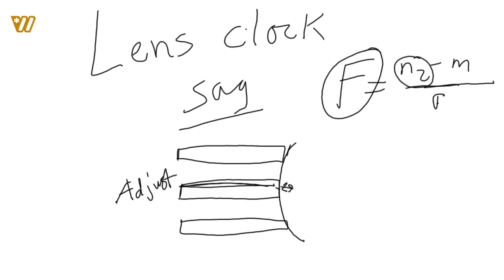So whenever you do lens clock, you get a sag value, but it doesn't actually give you a distance, it gives you a dioptric value, okay? And if you look in your text on how it works, all that information is right there for you. What you want to highlight is the second sentence. It says, based on the sag value and an assumed index in the value used for calibration, lens clocks give you a power readout.